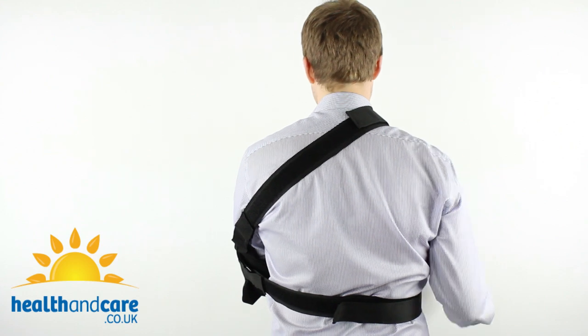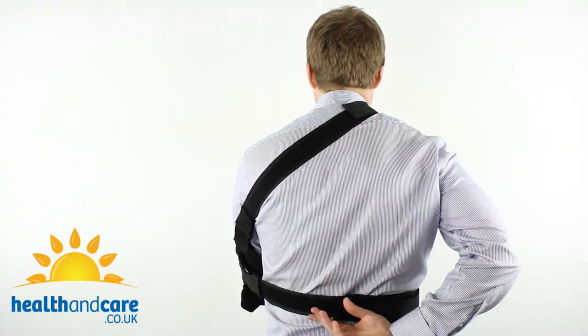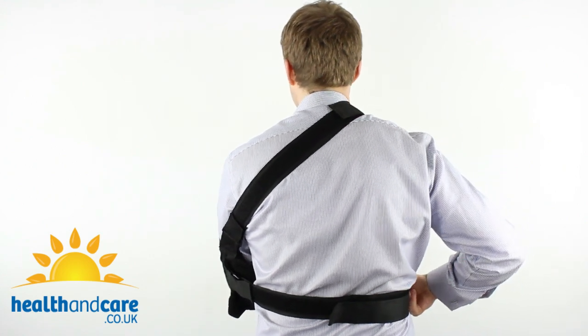Turning around to show you what it looks like from behind: there's a strap going across the shoulder and the immobilisation strap going from the elbow, around the back of the waist, to the front near the wrist. The sling is now in place and very comfortable.